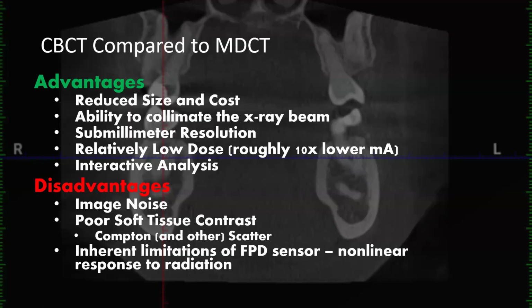And if they have that thin inferior border, or the external oblique ridge, which I haven't taught you guys yet, maybe I mentioned it, if that really stands out and they have marrow space that just looks really low density, they're probably fairly osteoporotic, and that's a risk factor for osteointegration of implants.